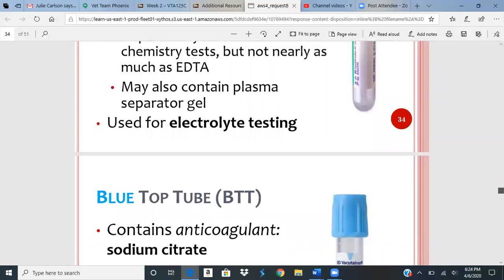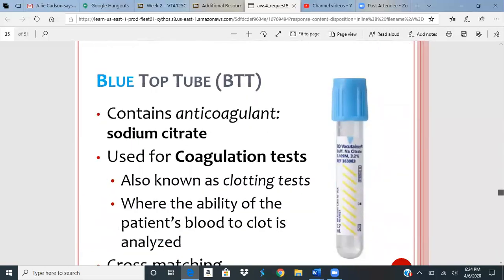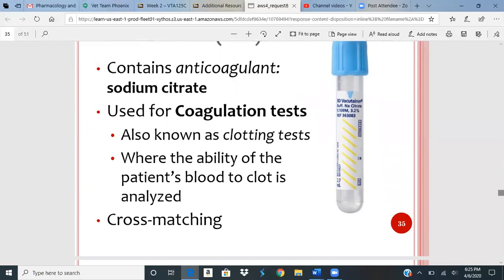Just if we're concerned about them being dehydrated, we want to see what their electrolytes are, we'll use a green top. Blue top tube has sodium citrate in it. Coagulation tests, again, if we're worried about them clotting, if we want to do clotting time, or if we need to do maybe a blood transfusion, we can use a blue top tube. That's what cross-matching is. We're going to cross-match, see if their blood matches another patient so we can do a blood transfusion.